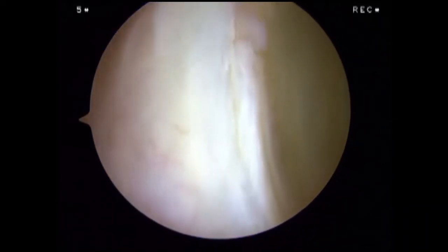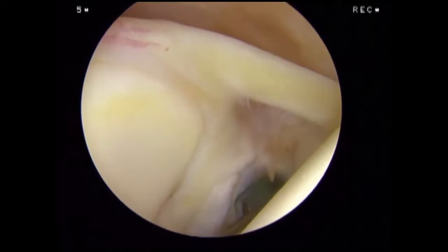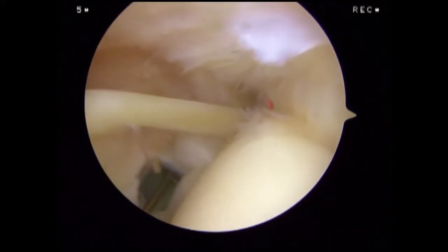At this point, our evaluation of the glenoid aspect is complete. We begin our assessment of the humeral aspect of the joint space by examining the attachments of the supraspinatus and infraspinatus tendons to the humeral head. Here, a partial tear can be visualized.